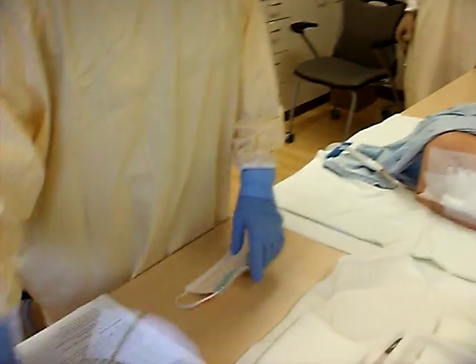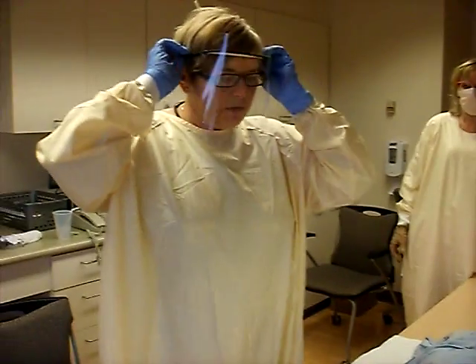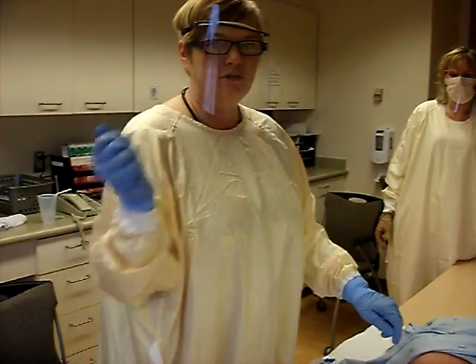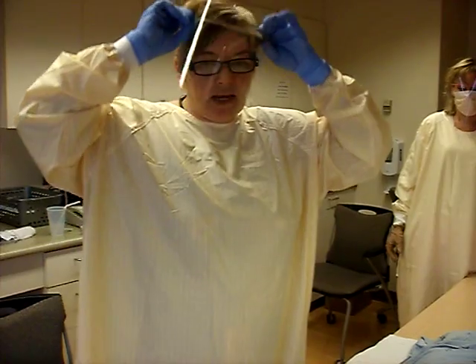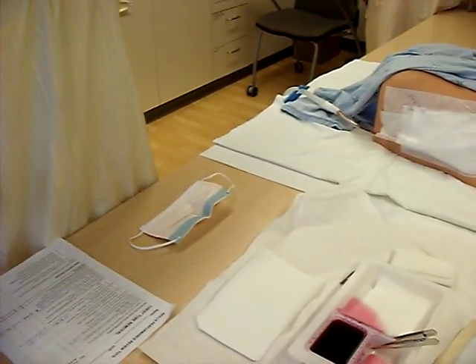And you'll also need to wear your eye protection in the form of a full face shield, because there may be some splashing from the removal of the tube. You certainly would not want to get any of that onto your face or in your mouth. So that's advisable as well.